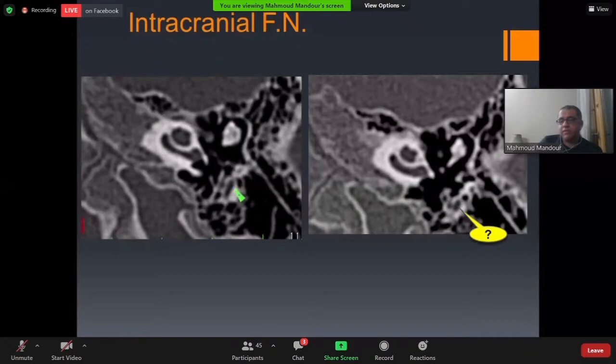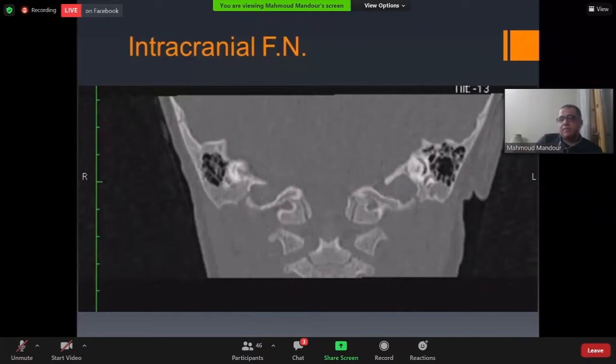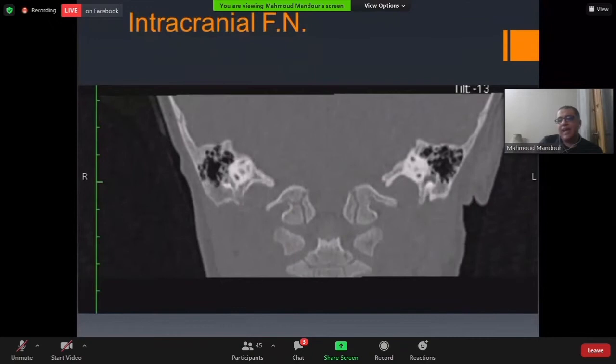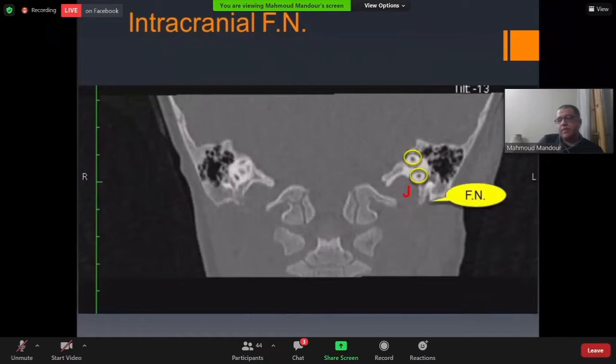In coronal CT cuts, we use the arch of the posterior semicircular canal as a landmark. Moving anteriorly, we can find both superior and inferior limbs of the posterior semicircular canal — they have a 'snake eye' appearance — and the facial nerve at the stylomastoid foramen.